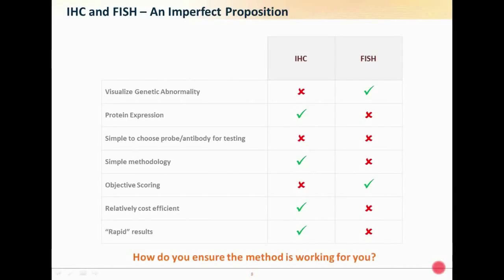Now, IHC then has the benefit that it's more cost efficient and will give you a faster result. Now, different labs choose IHC or FISH, or you do the screening with IHC followed by FISH. For us, it's not so much how you apply. It's more how do you know that if you are using IHC, it's working today, or if you are using FISH, the assay is working for you.